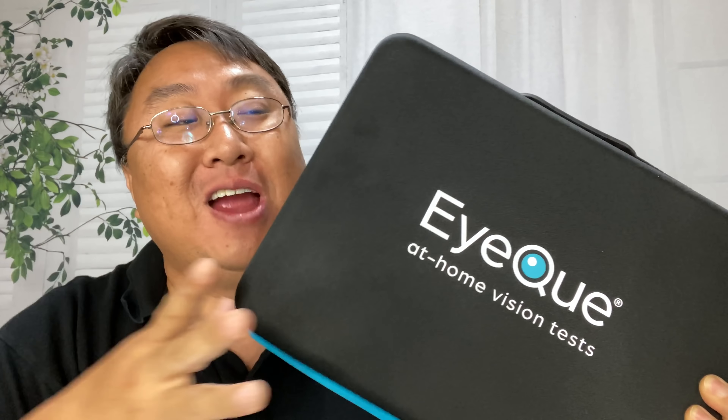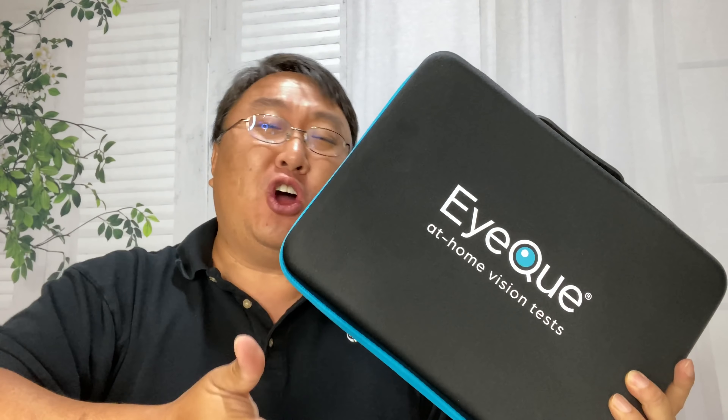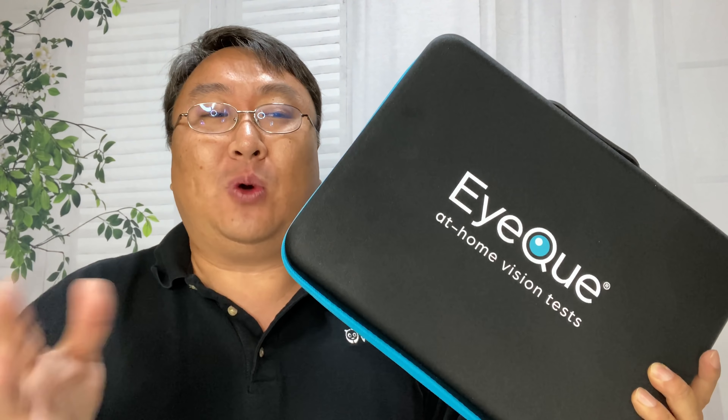Spoiler alert: I wear glasses. Now you may be at home, sheltered in place, or you may be like me, and going out to get an eye exam to buy new glasses is just kind of inconvenient. You've got to schedule the time to do it, it takes a while, you've got to go to an optometrist.